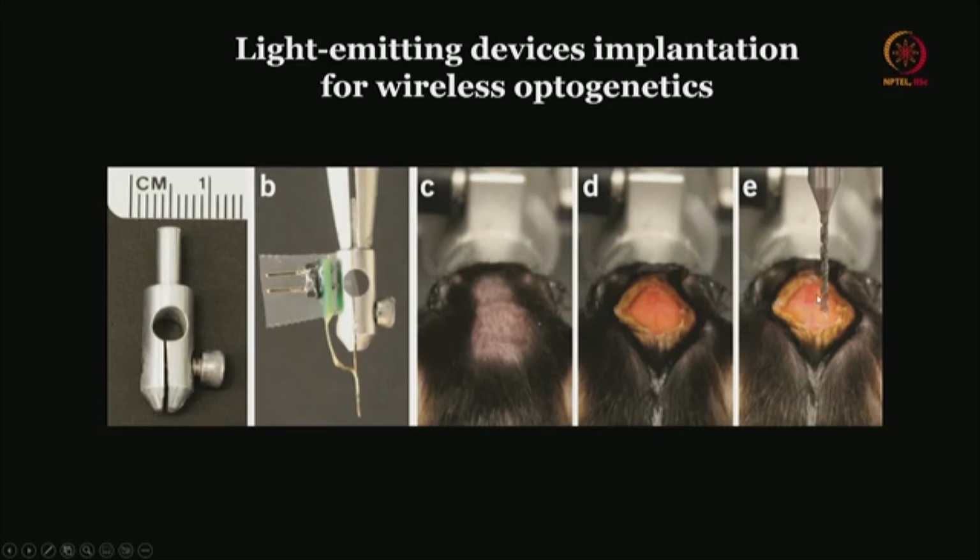And this is a different type of drill bit, called a twist drill, where the length of the drill bit is pretty long. I generally would not recommend this particular drill bit because you need to have a very good control in order to make sure that this does not go beyond the thickness of the skull, alright.